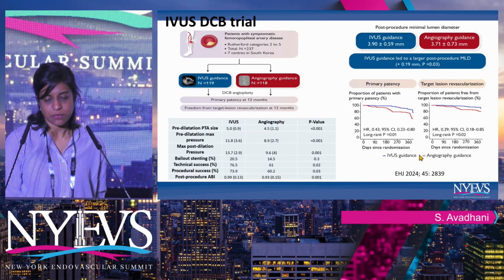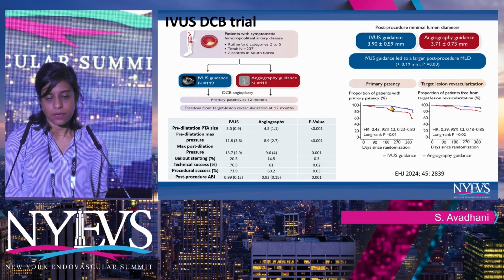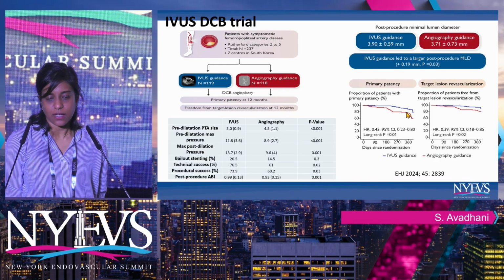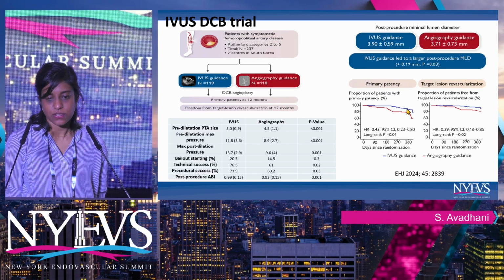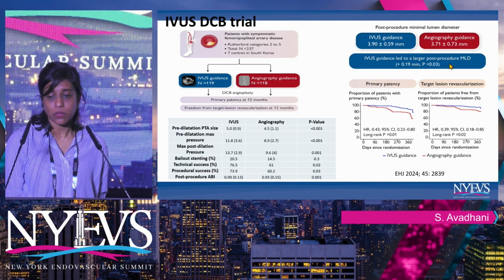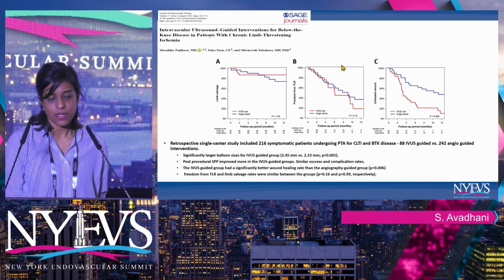And as you can see, up to a follow-up of 1 year, the primary patency rates and freedom from target lesion revascularization were significantly different and better with IVUS use. And IVUS use was associated with a larger post-procedure MLD compared to angiography alone.